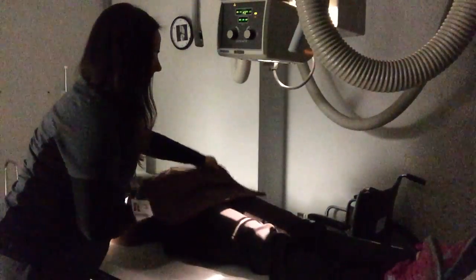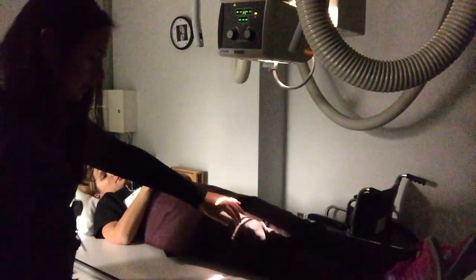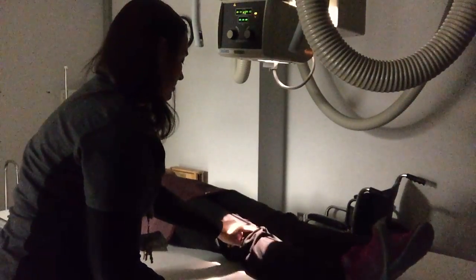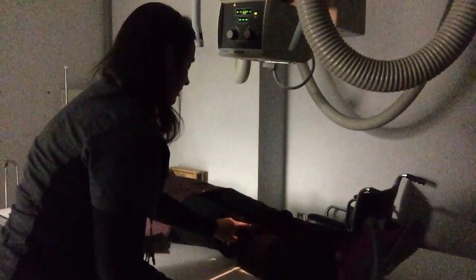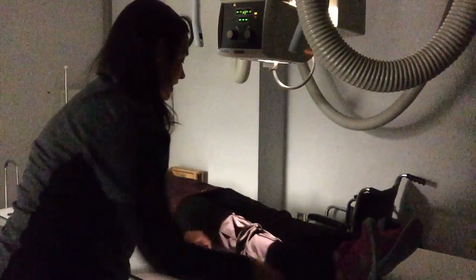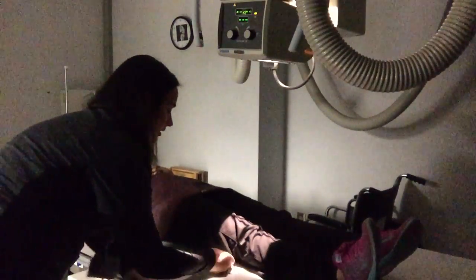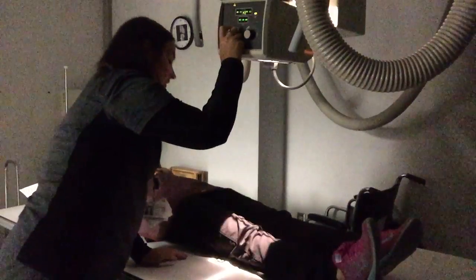All right, and next I am going to make sure I shield Mrs. Skaggs here. Okay, now I'm going to find her anatomy here, her patella, and I'm looking for the apex of her patella, which is the bottom of her patella. And then I'm going to go a half inch lower than that, and that's where I'm going to center. Alright, and I'm going to stick my marker in here on the lateral side, wherever I have a little bit of light. I want to make sure you're not in too close and you're in the anatomy.